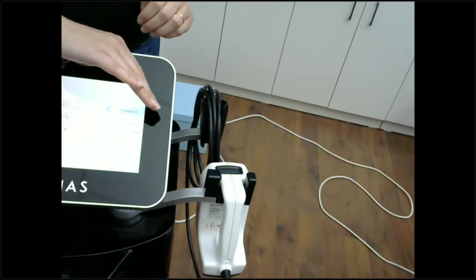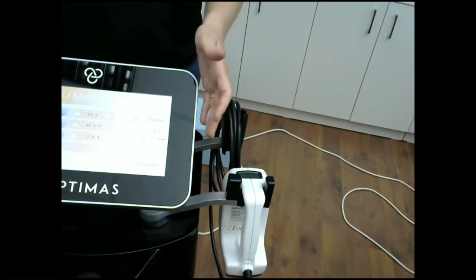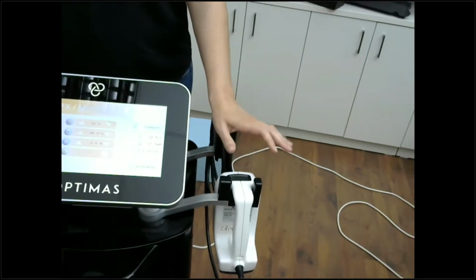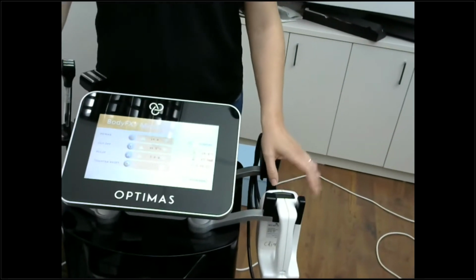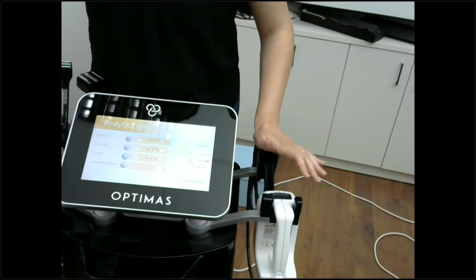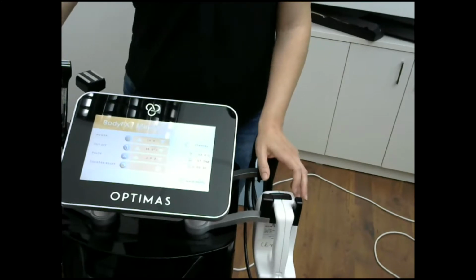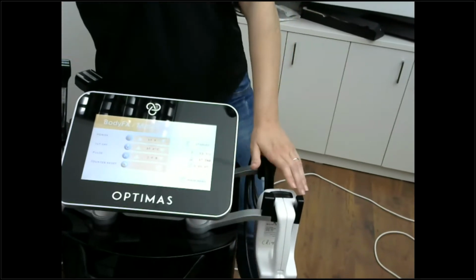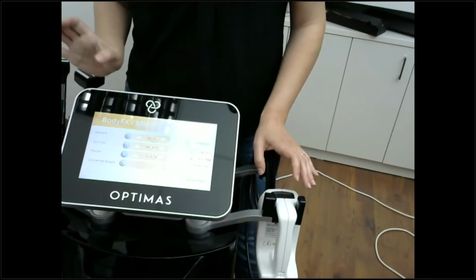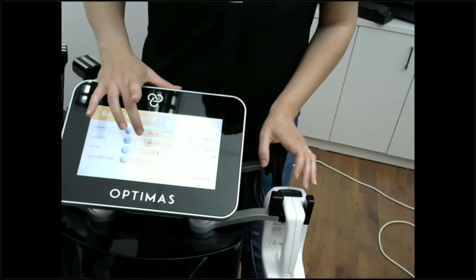So you're going to have to play with your system. Just connect it, and you see that you don't have to choose the right applicator, it actually recognizes it alone, okay? What we do have to choose, and again, you have it in your presentation, on your QRGs, and in the operating manual, are the power, the cutoff, and the pulse duration. So the power, as we said, should be anything between 35 to 40.